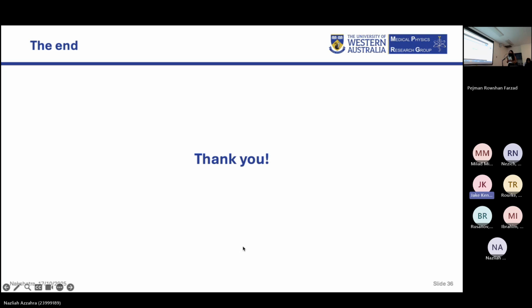And in this method, the initial positioning is done with SGRT, and then there's verification with IGRT as well. Oh, there still is. Yes, there still is. I was a bit surprised how small the difference was. IGRT is still recommended, and it is still the gold standard. It's just to avoid the tattoos and the other benefits.